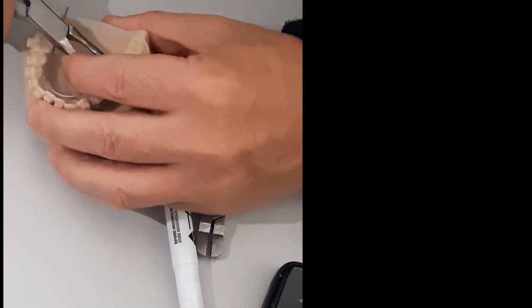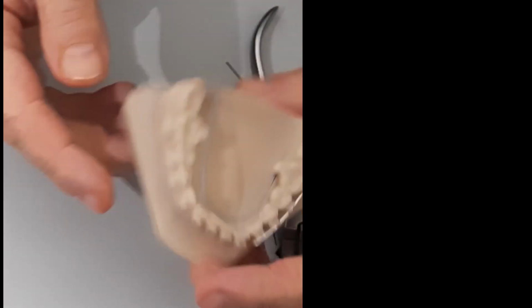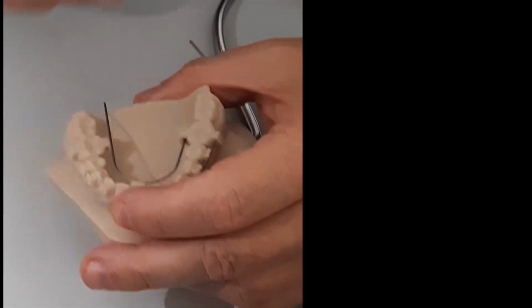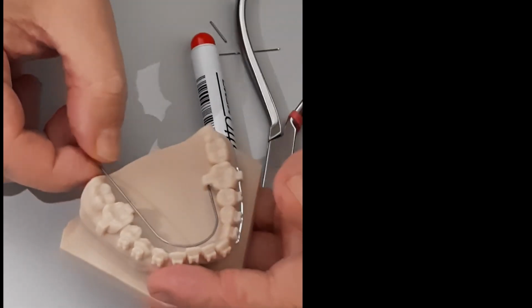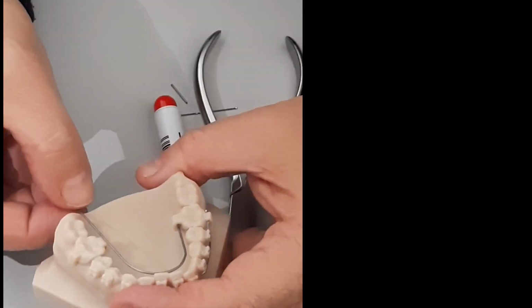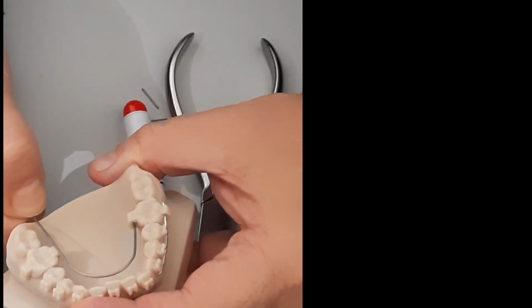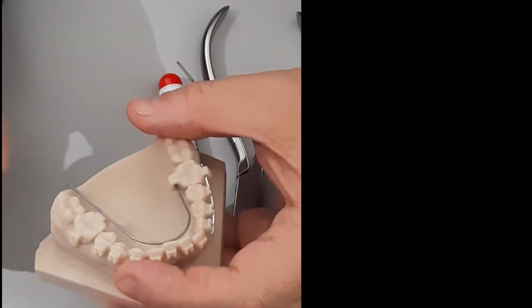And you can do this. Okay. And to tie it. Yes, it's important. So then you can bend it up, down, whatever. Now, after you have done the first one and you're still on time, if you need to make it a little bit shorter or longer. So normally, how much distance do you leave?